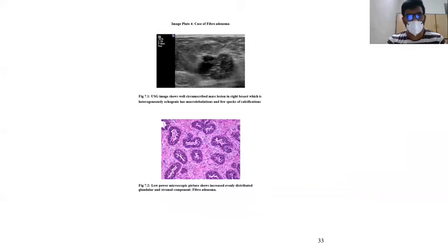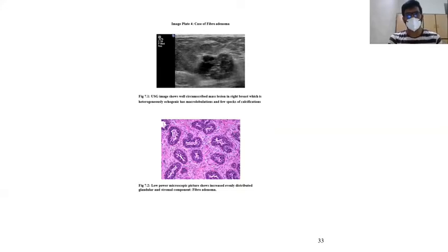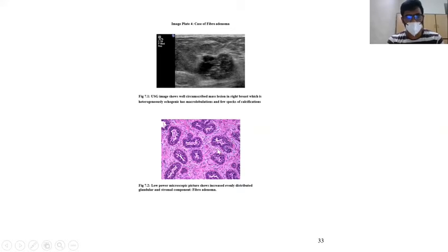This is the case of fibroadenoma. On this sonogram, we can see a well-circumscribed mass lesion which is heterogeneously isoechoic and has microlobulations with specs of calcification. The histopathological picture shows increased evenly distributed glandular and stromal components.